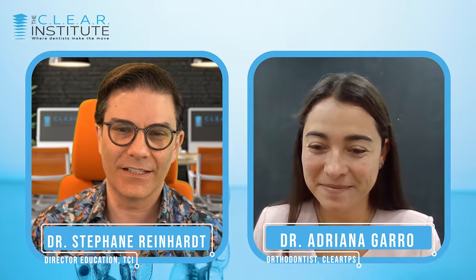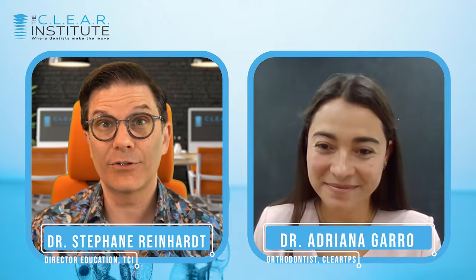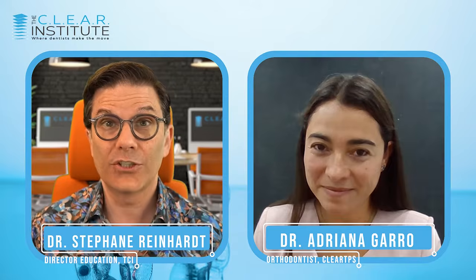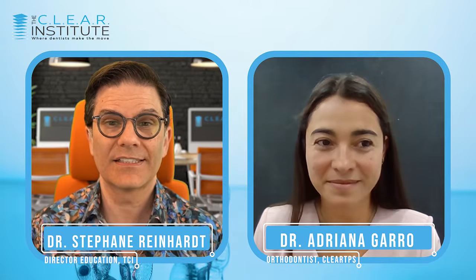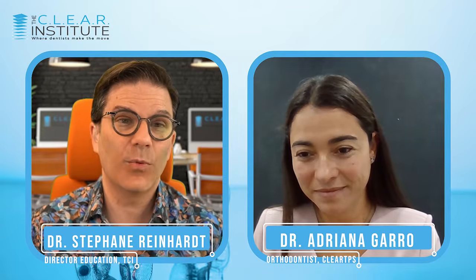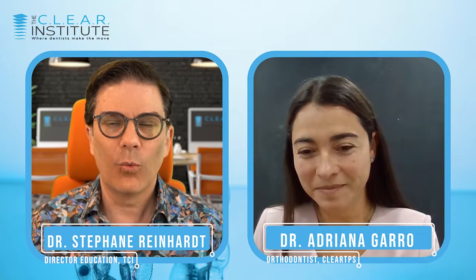We had a lot of views and comments on the first video we did together, talking about what you do at ClearTPS, and some of the questions people want to know. If I send a case, how does it work? What do you do with that?